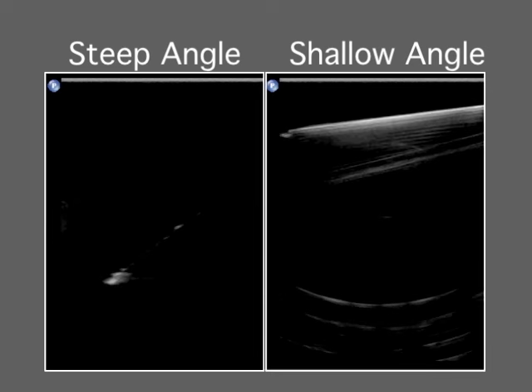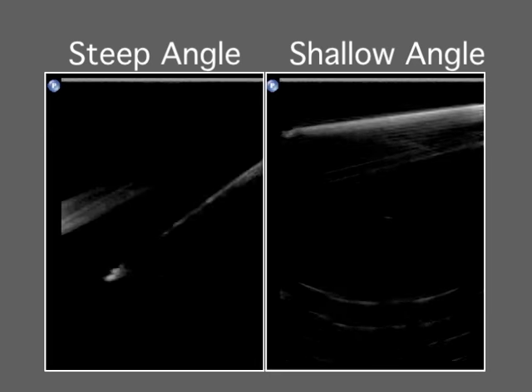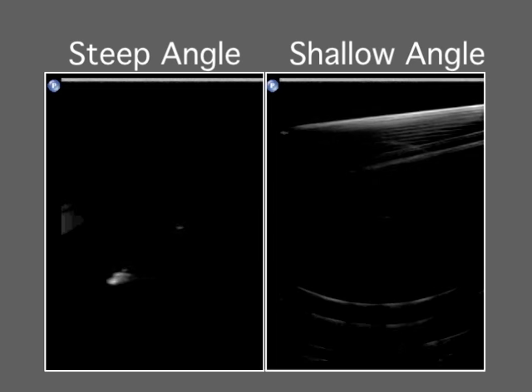This pair of sonograms shows the same needle at different angles in a water tank. The needle is much better resolved when it is inserted at a shallow angle relative to the transducer.